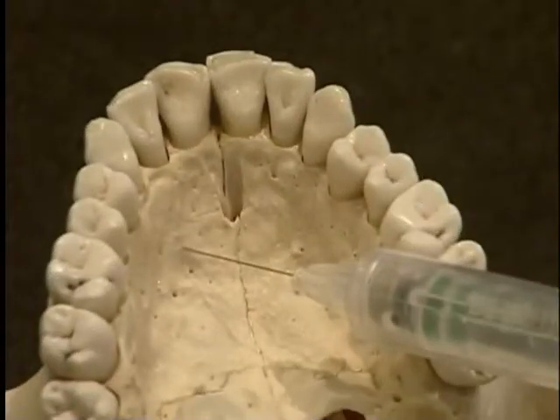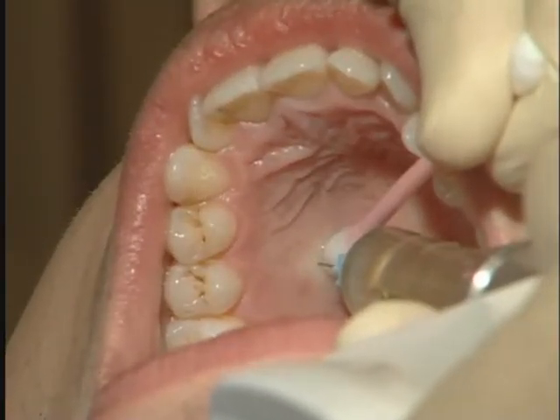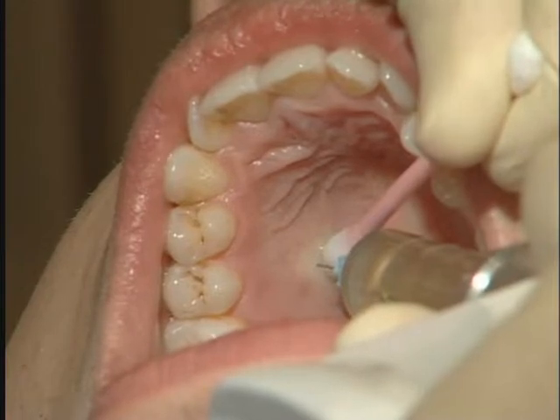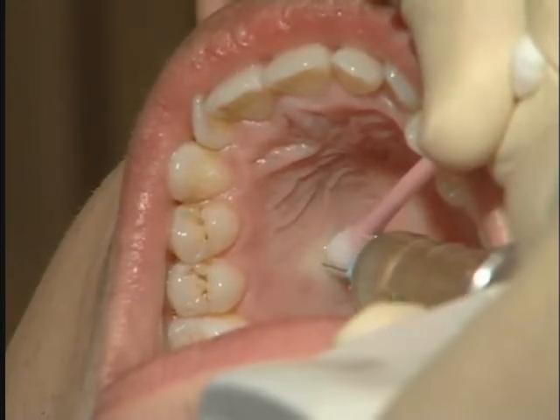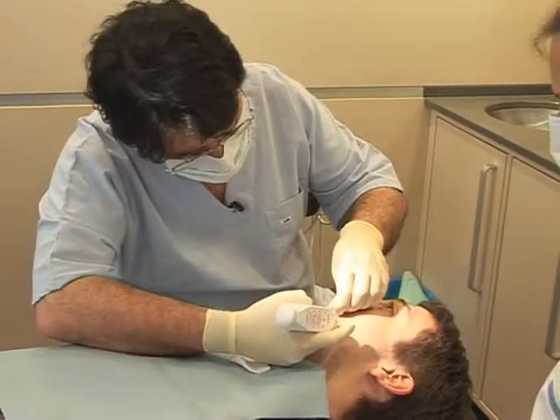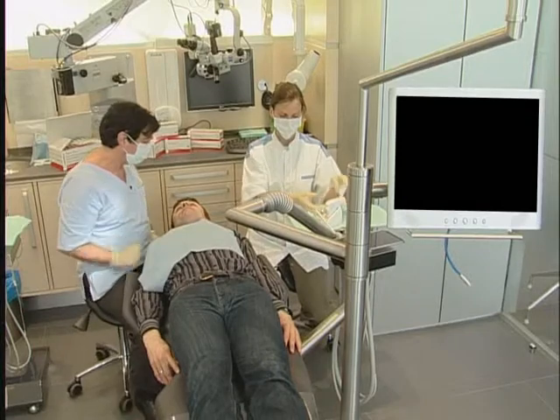This technique has some advantages. However, it also has drawbacks as the anesthetic onset is slow and there is a variable success rate of 35 to 58% depending on the tooth involved. We do not consider that it is a real alternative to the buccal route as its field of application is too narrow.